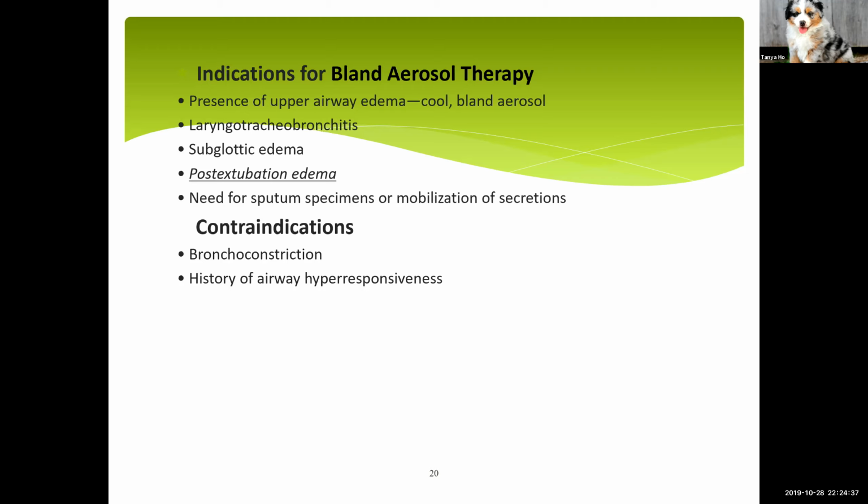Indications for bland aerosol therapy is presence of upper airway edema. So we talked about giving cool aerosol for upper airway edema, like post-extubation perhaps, like a nice cool mist to soothe their airway. We need to look this up and double check, but recently it was a standard of care for patients with croup, pediatric patients with croup. But I recall reading somewhere where they're saying there's no data to actually support this.